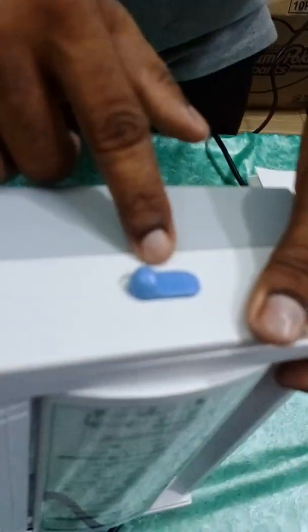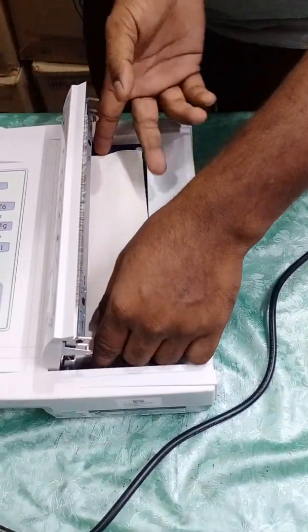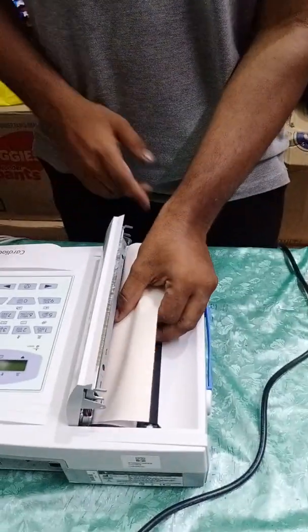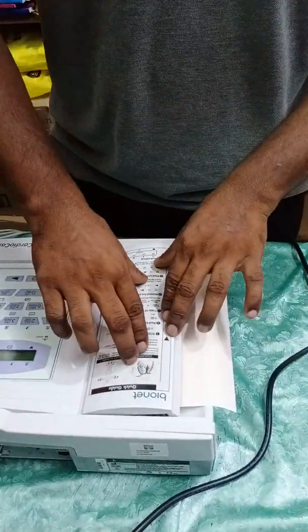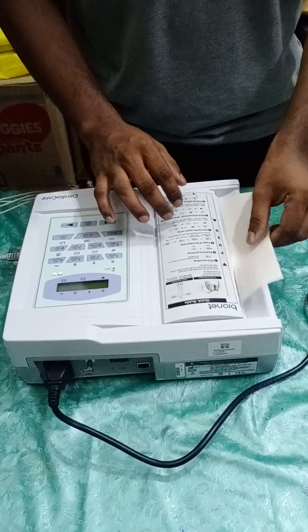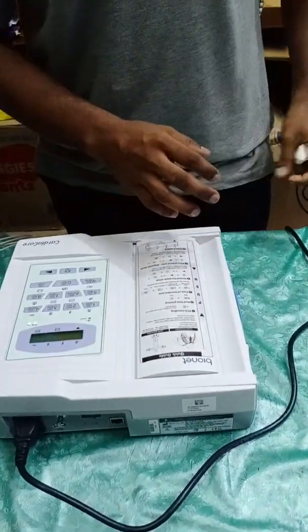This is the opening port of the ECG paper loader. With just a click we can find the slot for the ECG paper. You should insert the paper into this slot with the graph sheet facing outside. With a gentle push it will close. Once closed, just tear off the excess ECG paper.